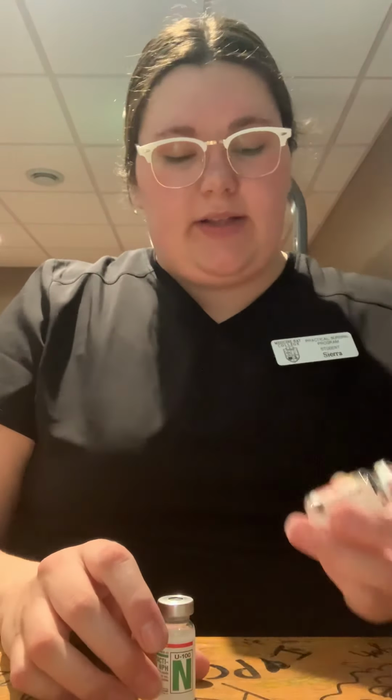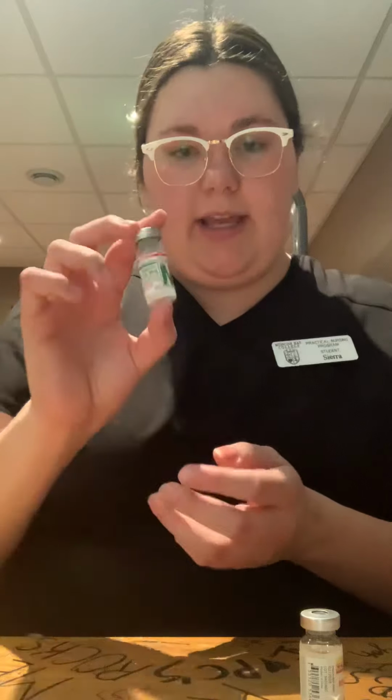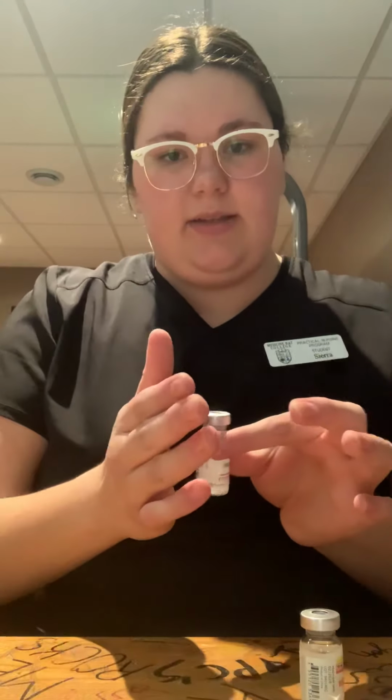So for preparing it, we've got to make sure our insulin is ready to go. So we just have our normal, this one, that's our R, and then we have our cloudy insulin, which is Humulin N, and that needs to be shaken. So I will shake this by just rolling it in our hands.